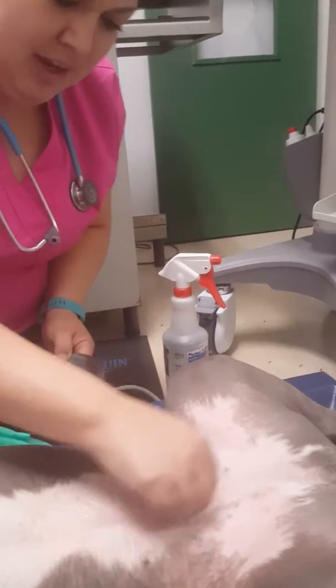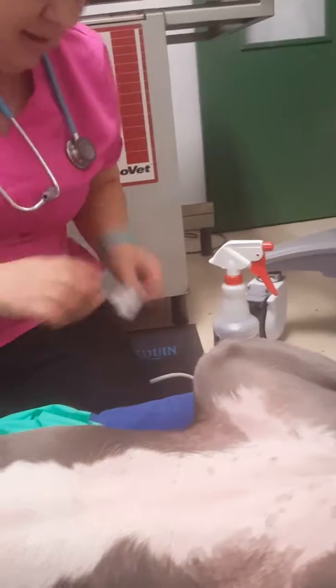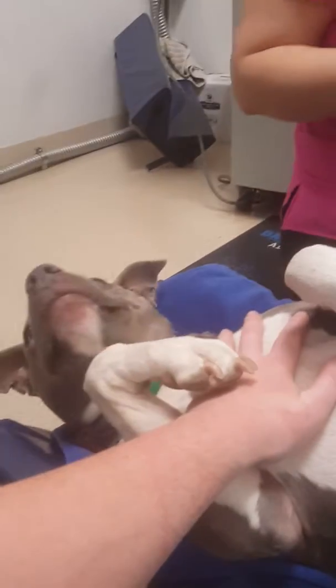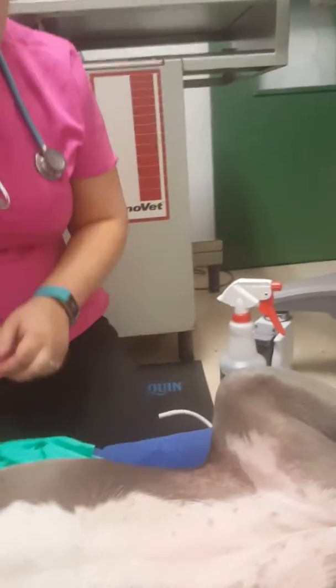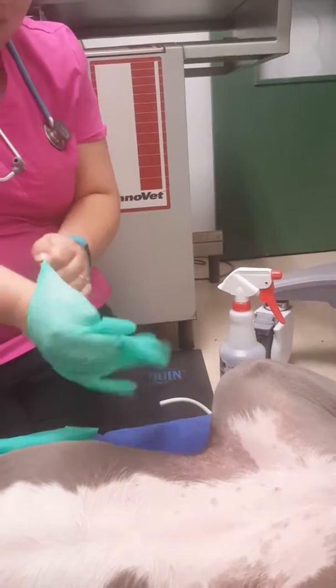For this patient's first time, I'm going to use a 22 gauge, one-and-a-half inch needle with a 10 ml syringe. I'm going to put on some gloves.